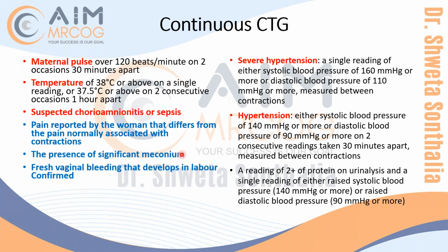There could be certain other indications, like continuous pain. If the pain is continuous and not relaxing in between the contractions, then you're worried about abruption, isn't it? So when pain is continuous, it is not a good thing. So you want to monitor the baby. Or if there is too much contraction, you also want to monitor the baby. Is the baby suffering? Because only in between the contractions does the baby get the blood supply. So continuous pain, you want to monitor.